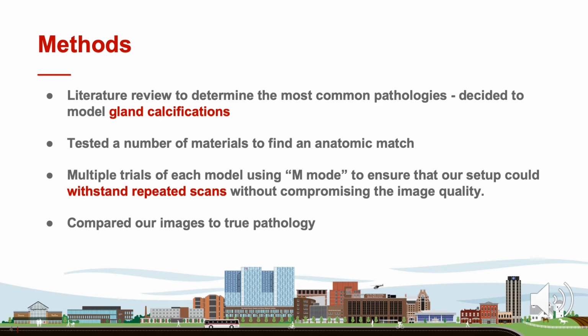After multiple trials of each model using the M mode to ensure that our setup could withstand repeated scans without compromising the image quality, we settled on a final gland representation on ultrasound. And then we went ahead and compared our images of the model to true pathology that we found through our literature review.